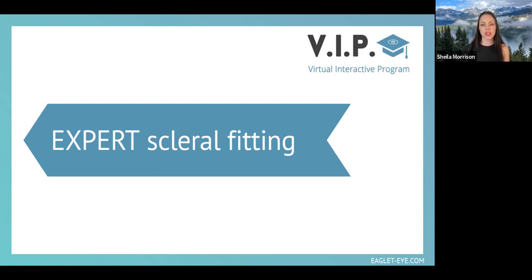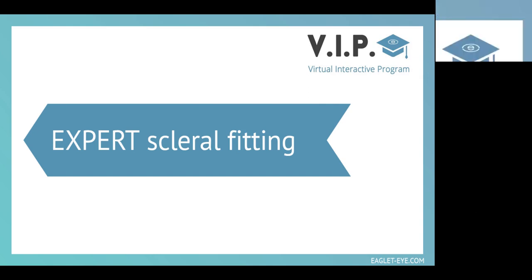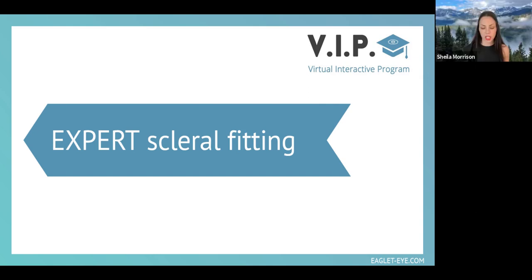Another one that comes up a lot in the clinic is surface wetting versus fogging. Midday fog is very different than a lens that becomes foggy from a non-wetting front surface. And that's something that we'll talk about in some of our cases. But essentially, there are two different types of fog that patients will present with. One would be fog that causes blurriness from underneath the lens. So that would be more our midday fog, debris that gets underneath the lens from external tears or from the external environment.